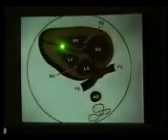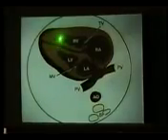It tells us that we are scanning the heart not from the apex but from the side. It's very simple: the more perpendicular the sound beam strikes, the better the image you get. And we all know that the interventricular septum is thick here and thinnest here, which we will discuss again when we talk about the membranous interventricular septal defect.